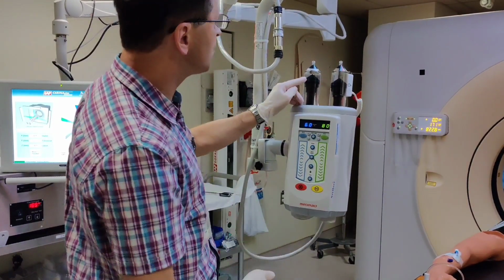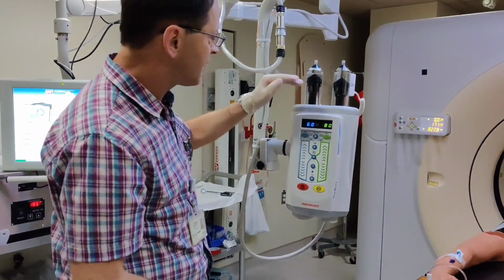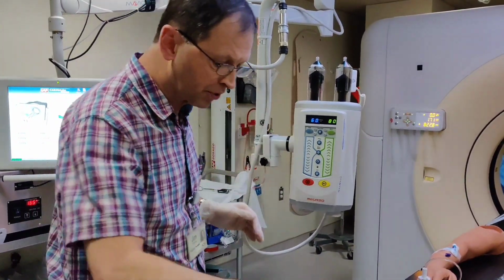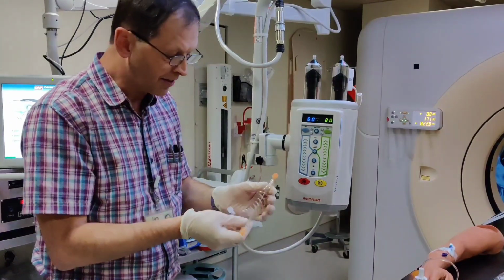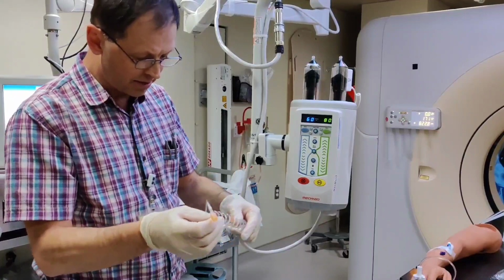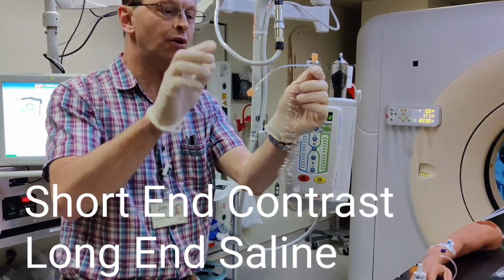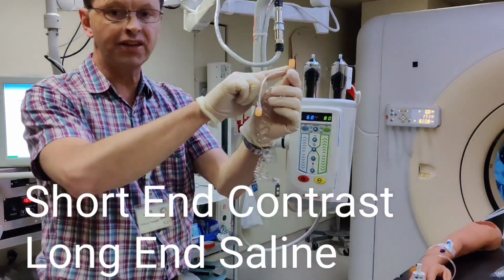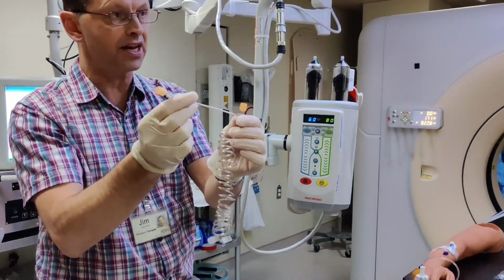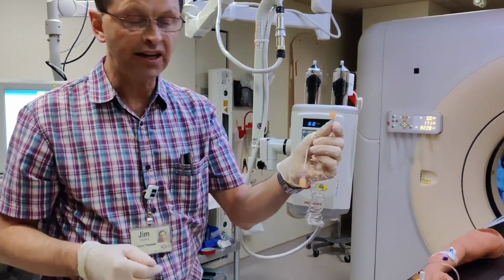You can see there's small air bubbles in there. There's really no need to tap those out. In fact, excessive tapping can over time damage the injector. So at this point, we're pretty much ready to connect the line that's going to go from the injector to the patient. So you have a T line here, T being for this portion of it. So the short bit always goes on the contrast side, and then the longer bit extends over to the saline side. So again, we're going to exercise care in terms of not contaminating anything.